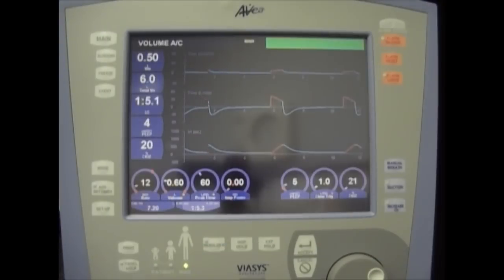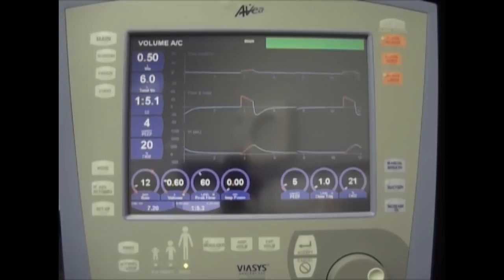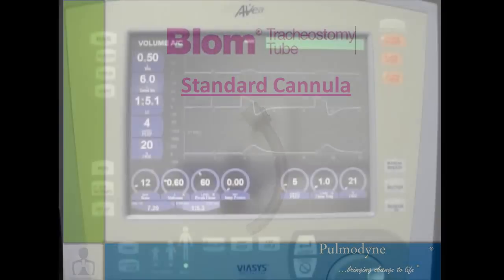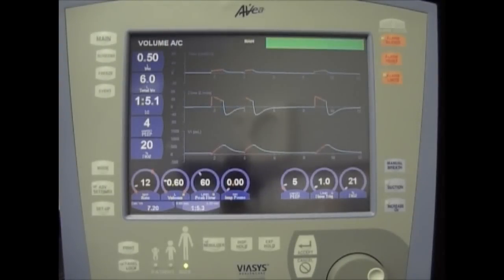Here we have the Blum Tracheostomy 2 with the Viasis Avea Ventilator. I will be demonstrating how the Blum Tracheostomy 2 interacts with the Viasis Avea Ventilator. This is with Blum's standard cannula in use.